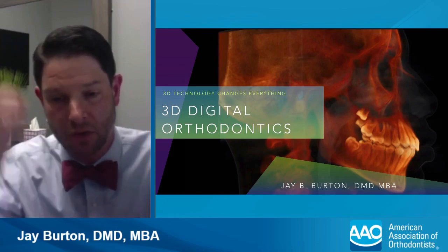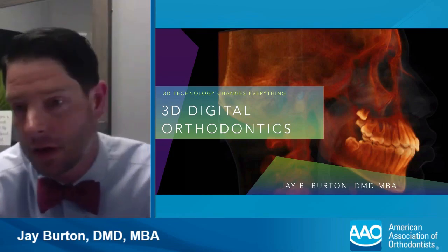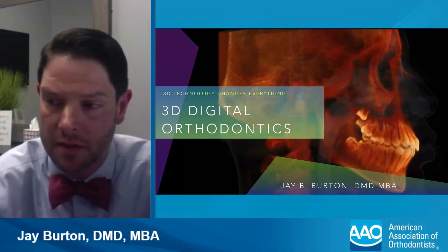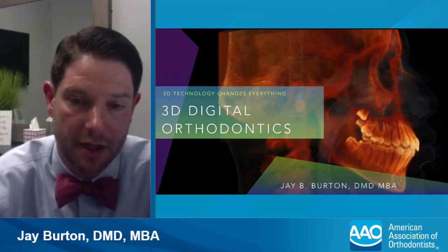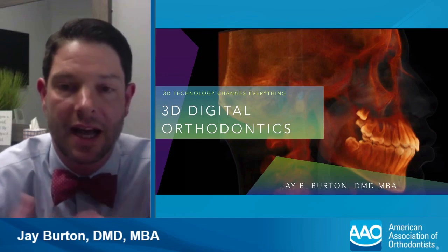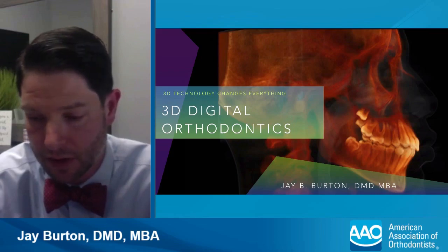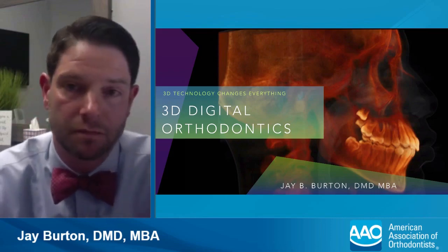If I had a practice where I was treating 80% adults, maybe I would be less inclined to say you should think about upgrading. But I think it depends a lot on your patient population. If you were treating a whole lot of kids, that would incline me to adopt ultra-low dose technology. Chances are you've already depreciated the machine anyway. You could use the tax write-off, so why not?